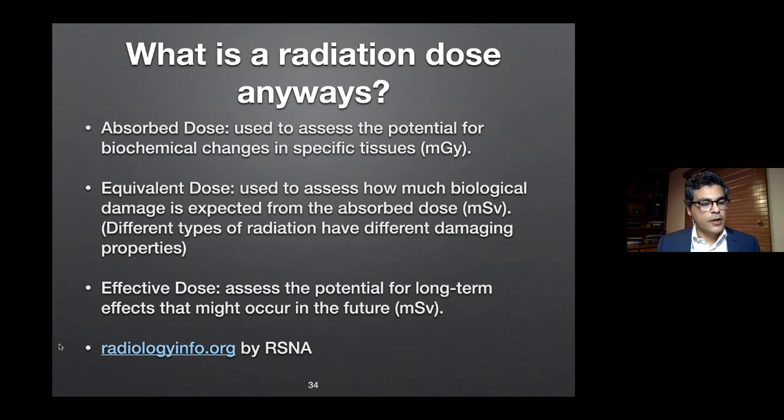For all practical purposes, as clinicians and as concerned patients, absorbed dose and equivalent dose are not that important. They're important in calculating the dose itself, but it's the effective dose that we are looking for.